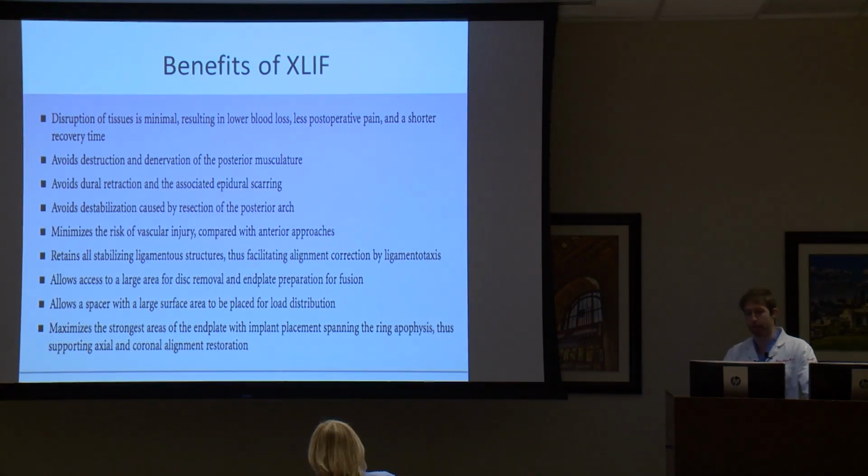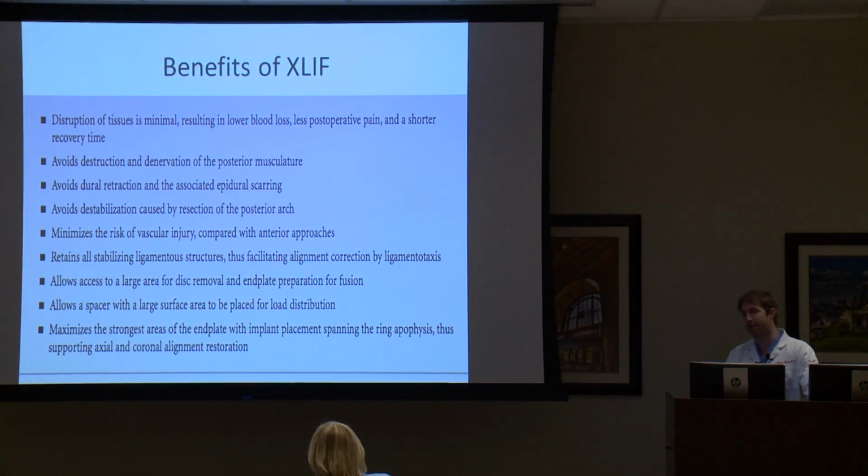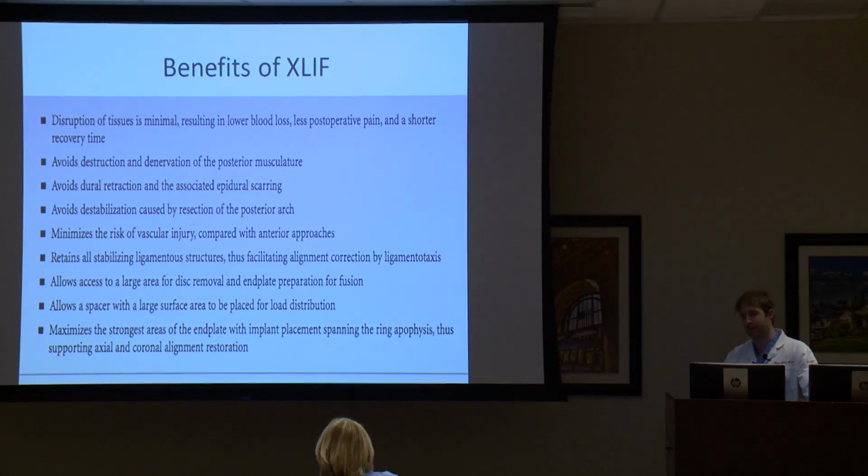And like I said, you don't denervate the posterior musculature because you don't have to take it down. You don't have to pull on the dura at all, so you don't have to worry about getting into that or messing with the nerves too much. And we'll talk about other reasons that we can avoid that in a second. You don't destabilize anything because you don't mess with the joints per se, so you don't take down the ligamentous capsule.